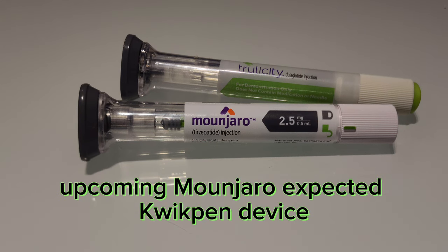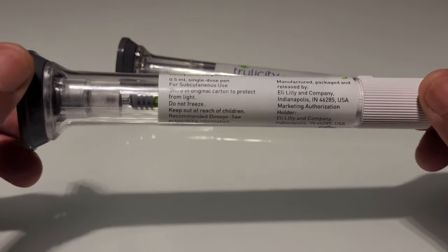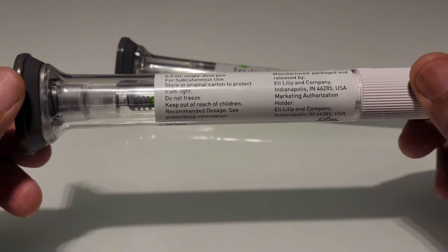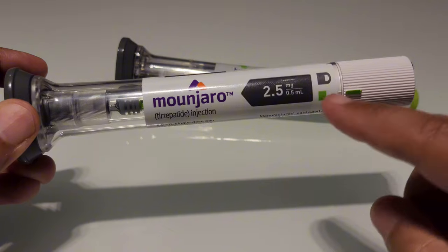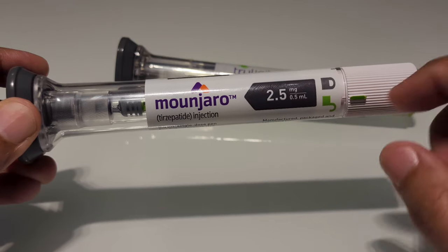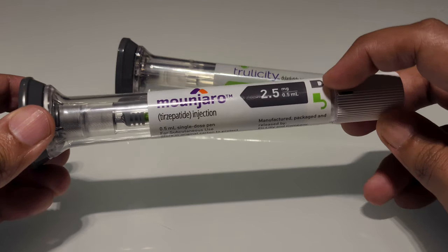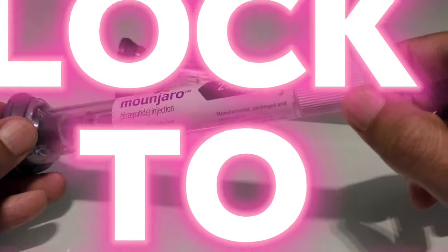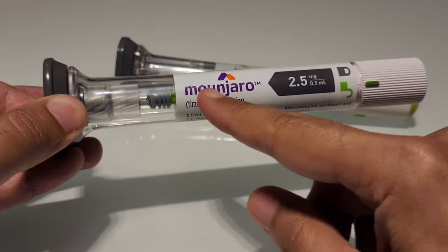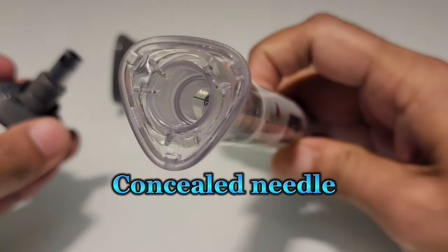The current Mounjaro pen device available across the globe is an auto-injector. This auto-injector is a single-use, single-dose device which will inject only one particular dose mentioned on the pen — in this case 2.5mg — and is used only once, after which it is discarded. It has a lock and unlock icon at the back, a dial which moves only once from lock to unlock, and a press button. The drug is present in a glass tube, while the needle is not visible — it is hidden.